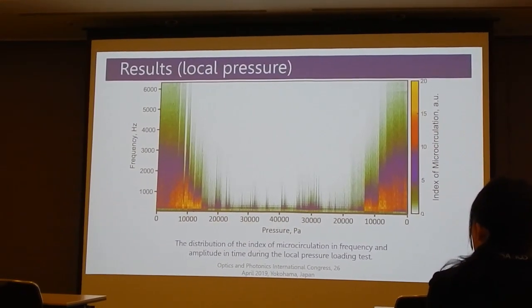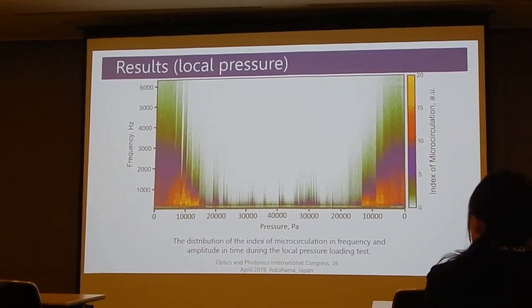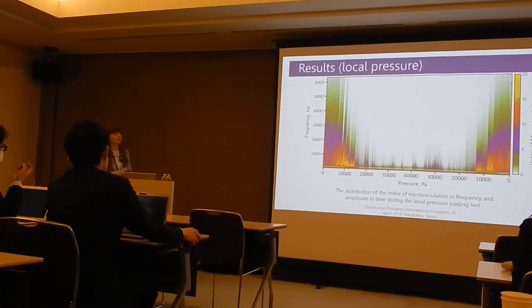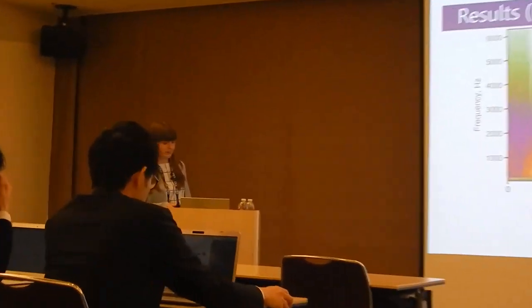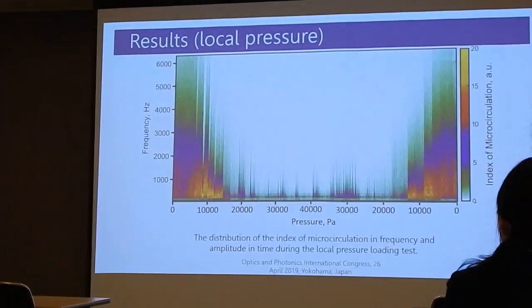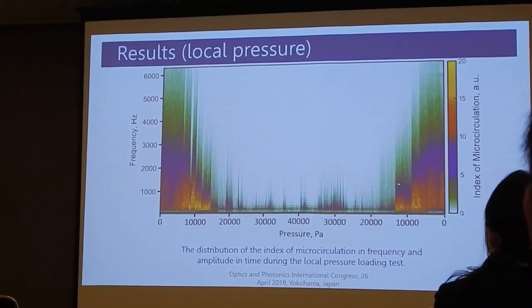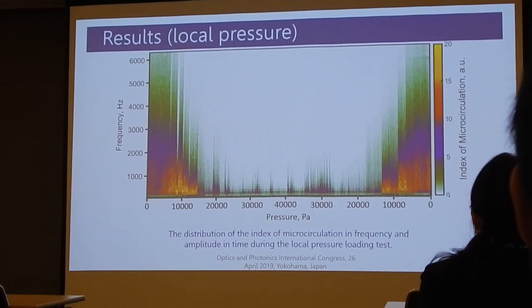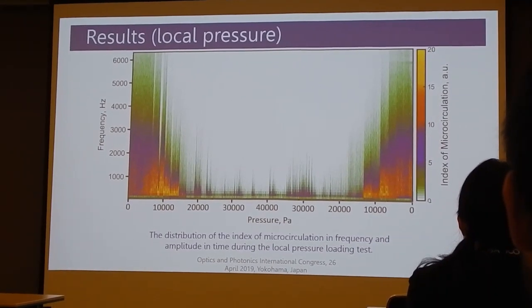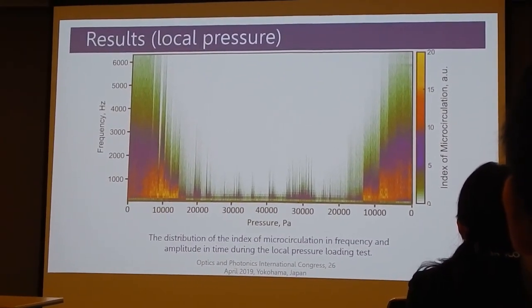Yes, it's connected with the experiment, because in this experiment the influence of local pressure on the signal was studied, and we added weights to provide the pressure. In this part of the study, we added weights, and then we unloaded the tissue. I think it's connected with removing the weight, and when the pressure decreases, the signal rose significantly at this stage.